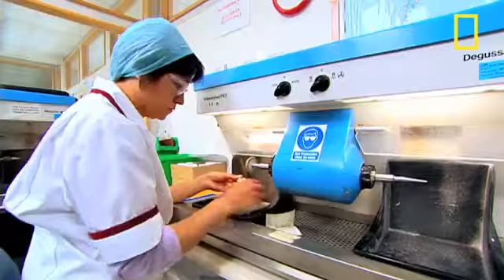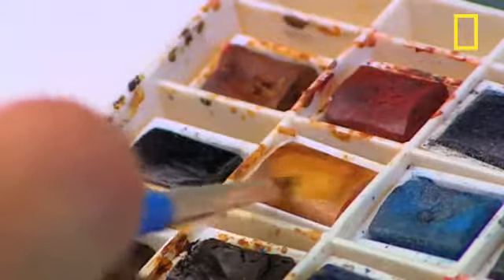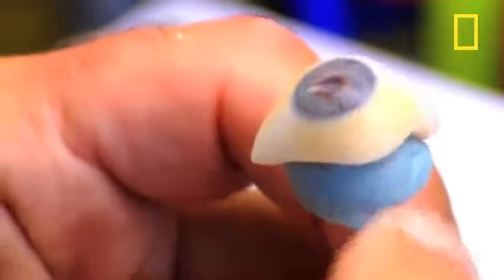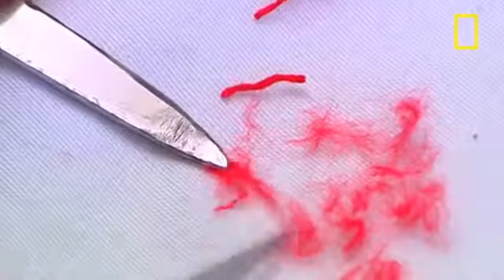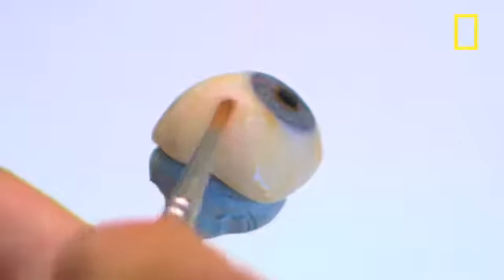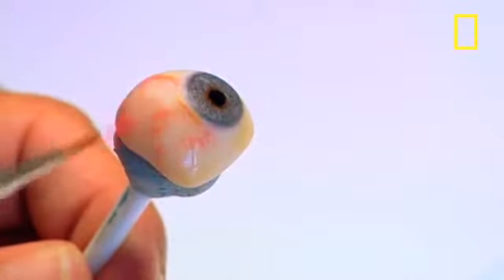The excess acrylic material is trimmed away on a grinding wheel, and the eye gets stained and veined. The average human eye isn't snow white, so a bit of watercolour paint is dabbed around the edges, depending on the patient's natural colour. This embroidery silk is used to replicate the veins of the eye. The thread is separated into individual fibres and applied with an acrylic varnish. Just 1 centimetre of this thread will provide enough fibres to make over 100 eyes.